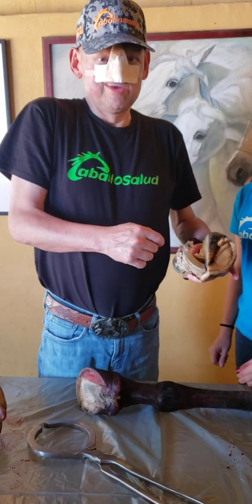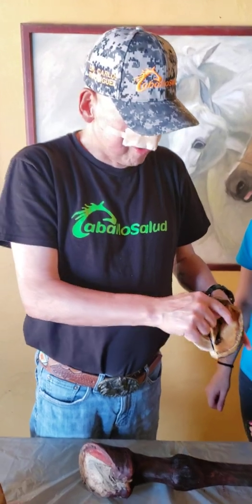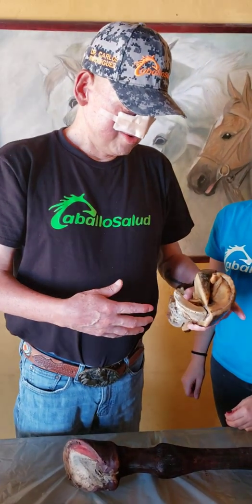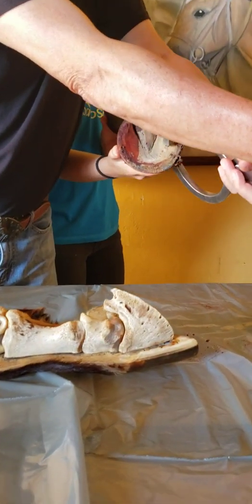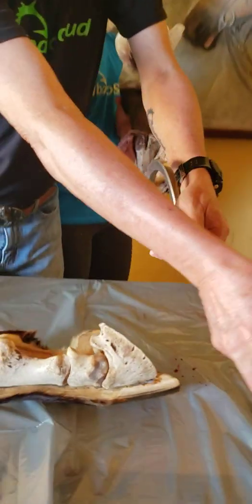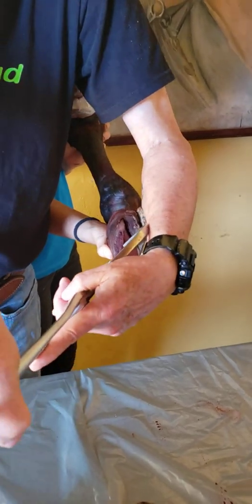So if a horse shows a positive reaction with the hoof testers, I can imagine the affected area is here, or here, or here. And so I can direct the treatment to the appropriate area. Imagine that this is a horse — I am going to apply pressure here in the margo border, and step by step I am going to do a topographic revision with my hoof testers to locate exactly where the pain is.